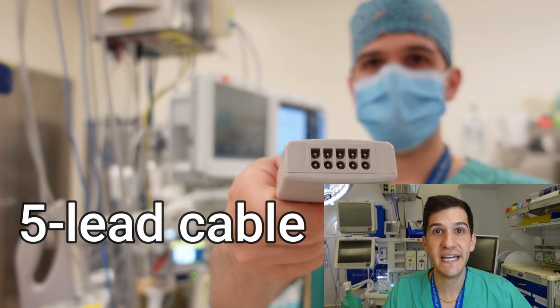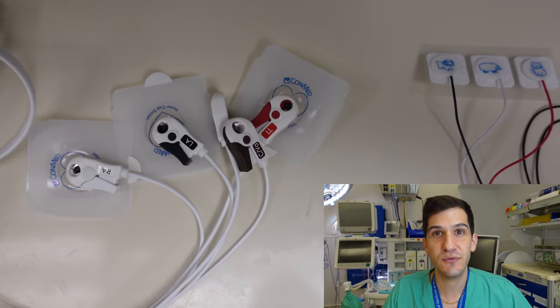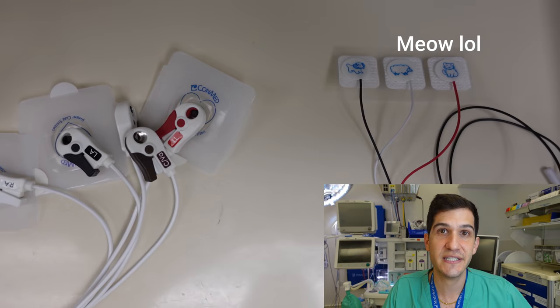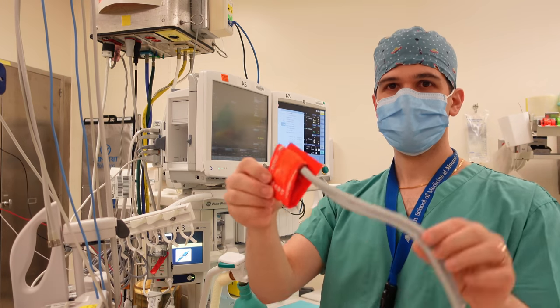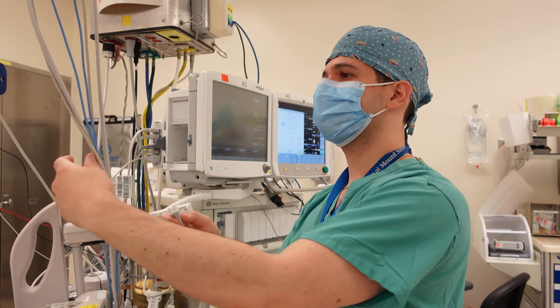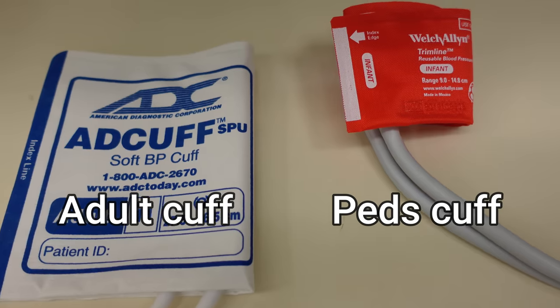The second M in the mnemonic stands for monitors, and there's quite a bit of changing around that I need to do from my adult setup. I'll start by changing out the EKG cable — instead of using a five-lead EKG for an adult, I'm going to be using a three-lead EKG with the infant EKG lead setup. Next up is a pulse oximeter; we have a lot of different sizes available for pediatric cases and the one I'm using here is one of the smallest. Next is a blood pressure cuff — we actually have even smaller ones, but this should be appropriate for the patient's arm or leg.